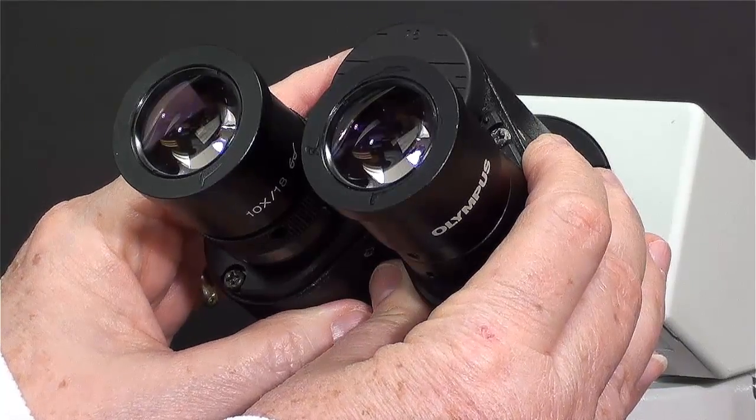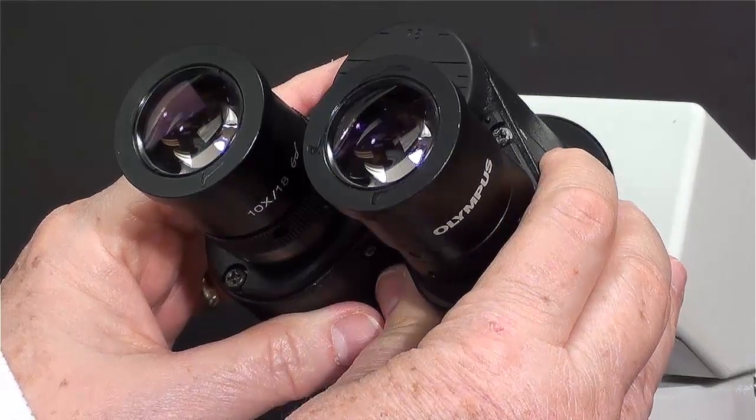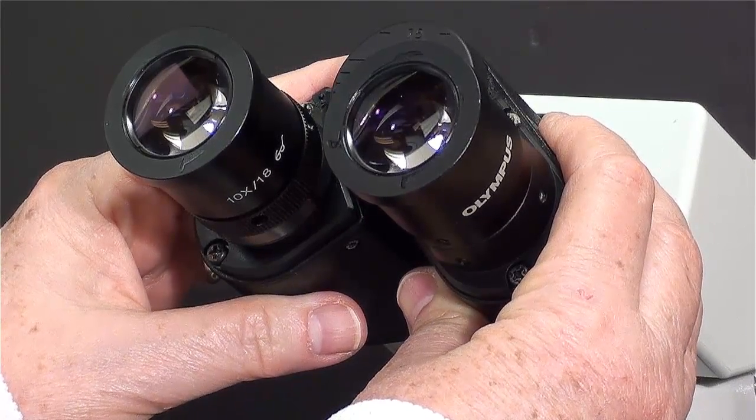Place your head about three quarters of an inch from the surface of these lenses, with your two hands pull them apart, until both eyes are actually seeing the object you want to look at.